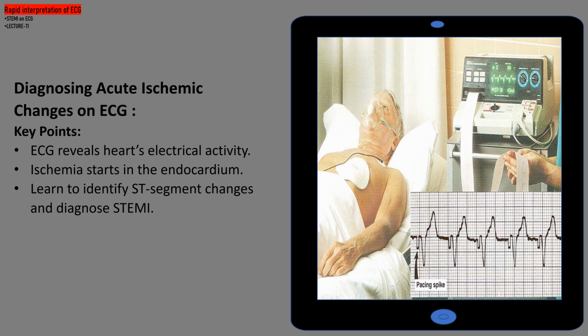The ECG is like a window into the heart, revealing its electrical activity in real time. But did you know that a heart attack doesn't just appear out of nowhere? It starts deep inside, in the most vulnerable layer of the heart, the endocardium.